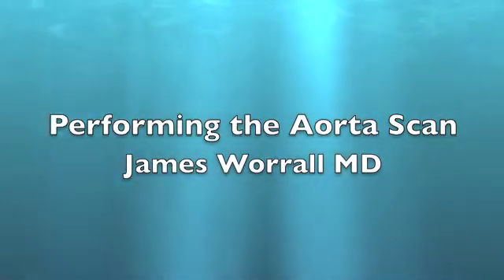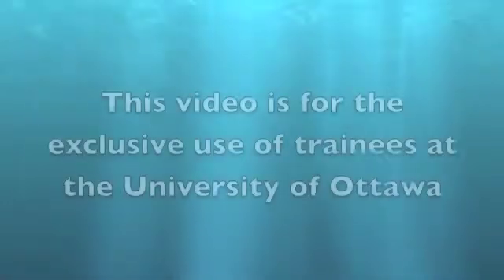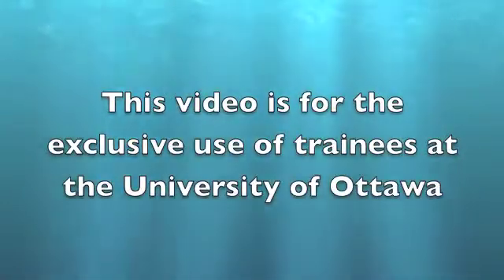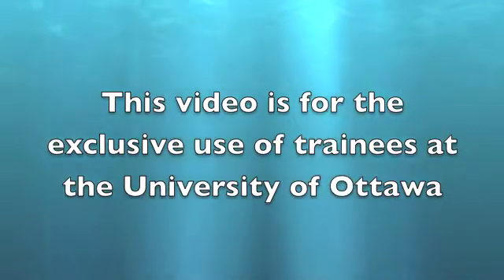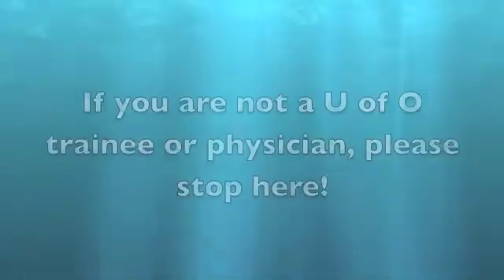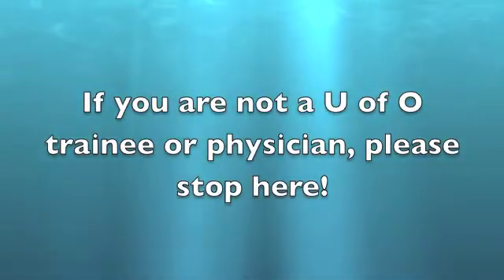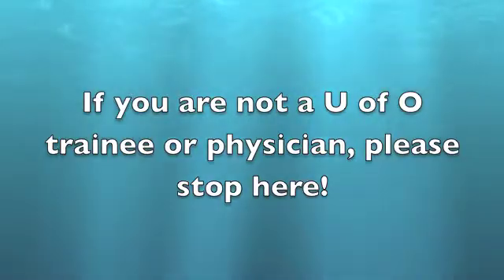In this video, I'm going to teach you how to scan the aorta. The basic technique is simple, but how do you deal with the patient who's challenging or who has a lot of bowel gas? Let's learn how.